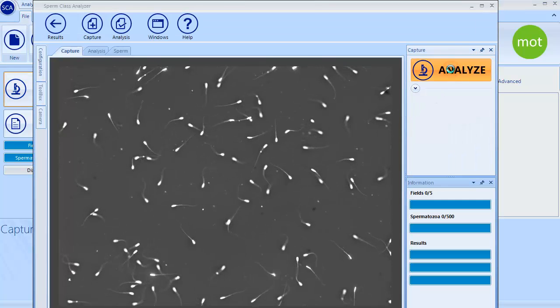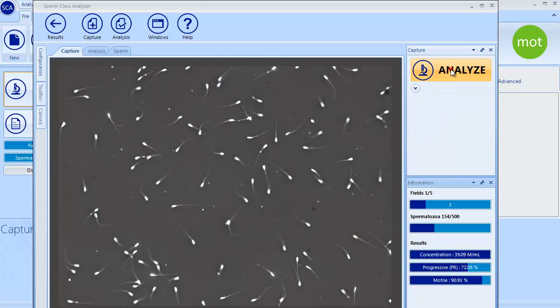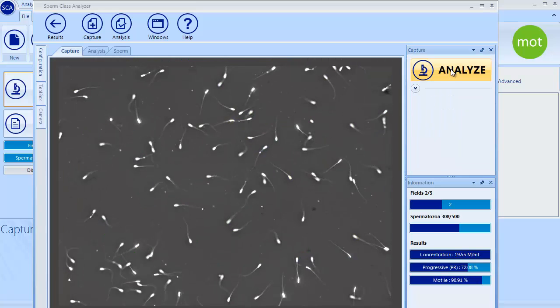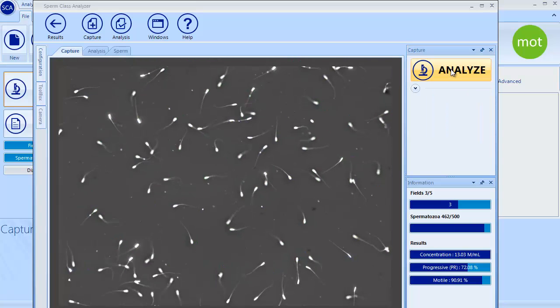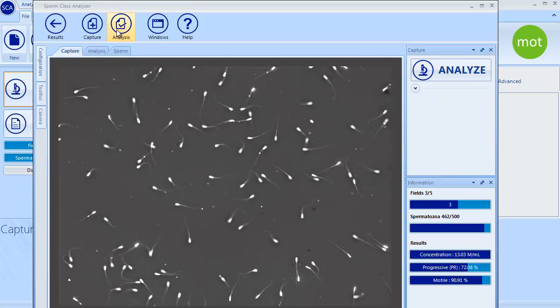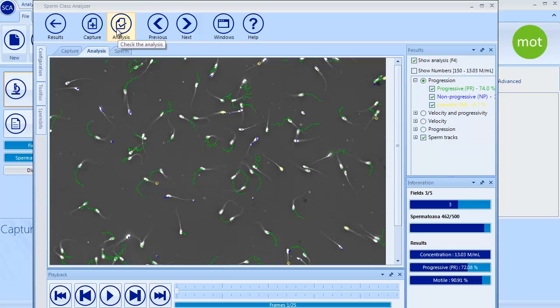Live image is displayed. Focus the field and start the analysis by clicking again the Analyze button. Main analysis information is always present on this side.